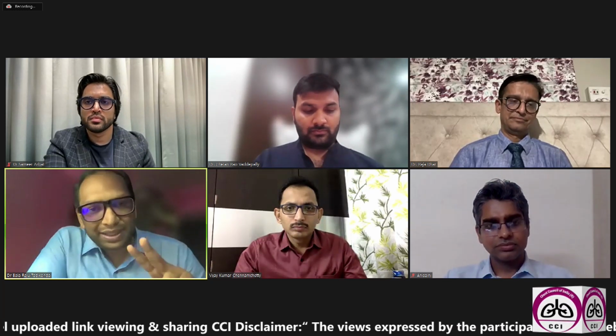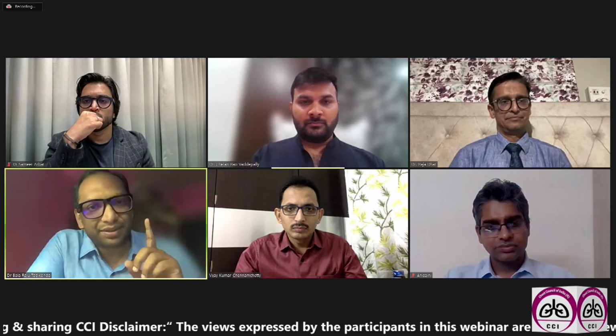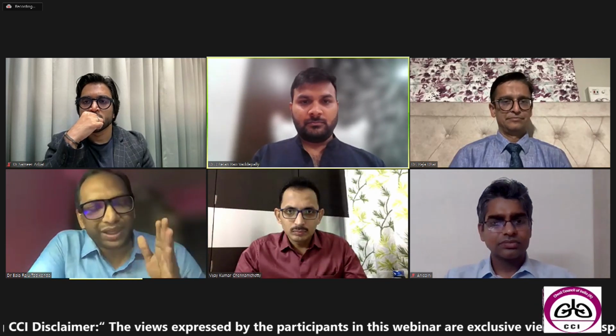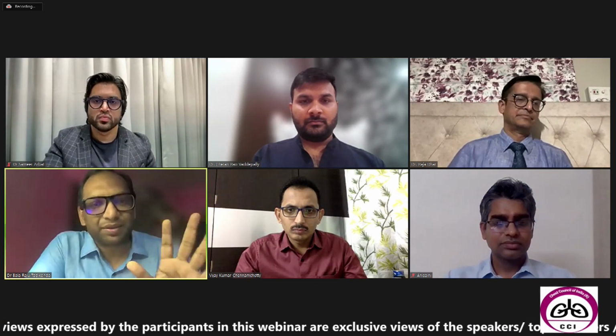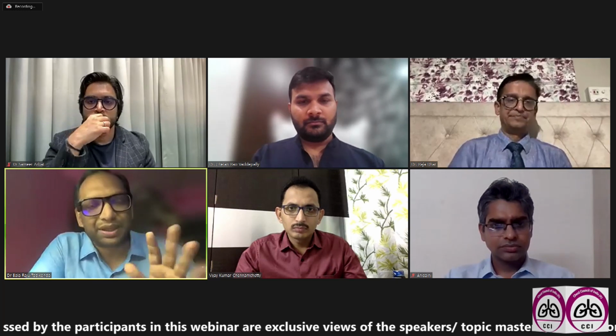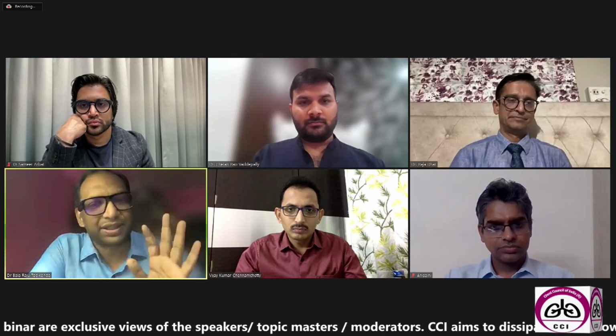Two main things I want to add, because Dr. Chetan raised this point. The first thing is the balloon you choose. What I've seen in these many years is that inadvertently your Fogarty balloon will rupture, in the first pass or second pass. The best balloon I've ever encountered is the Arndt's bronchial blocker. It is the best of the best, very stiff and rigid, and it doesn't move around. Till now, I have blown away many Fogarty balloons, but I have never blown away an Arndt's bronchial blocker. This is what I have learned in my procedures.